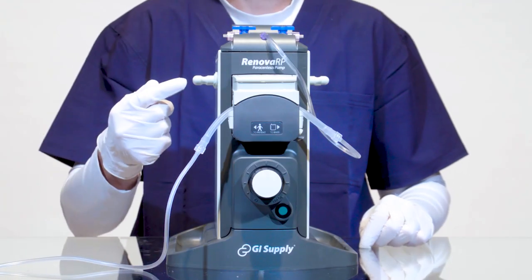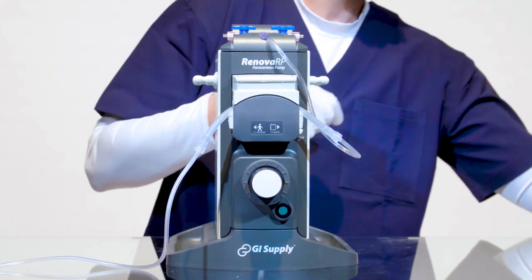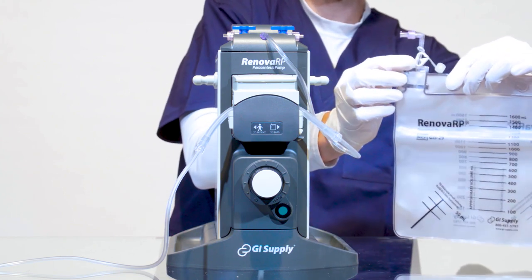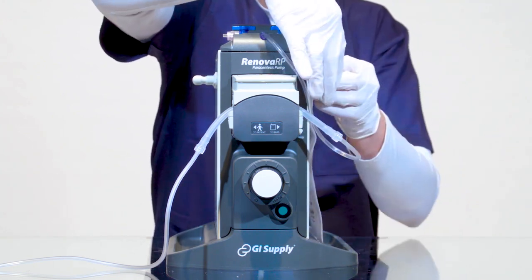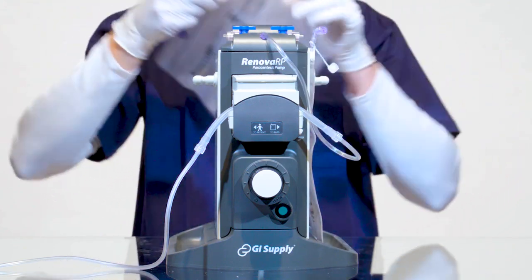With the tubing properly in place, we can hang and attach a drainage bag on either side of the pump. Confirm the white pinch clamp on each bag is in the open position and then hang the bags using the posts on the side of the pump.